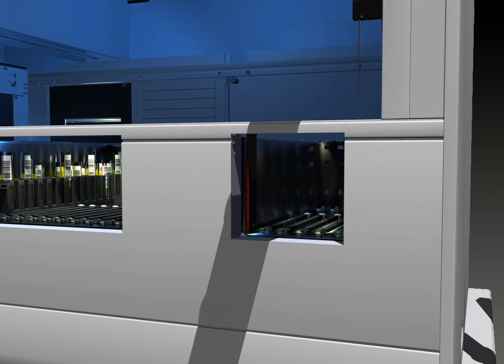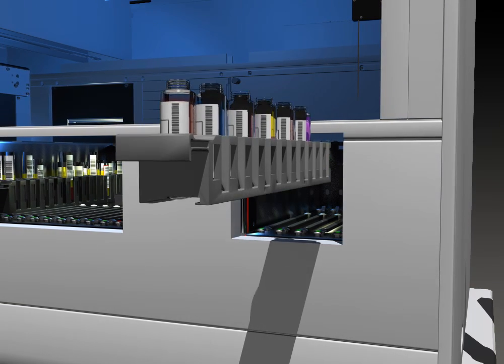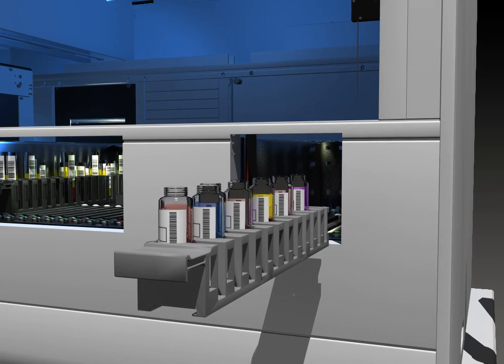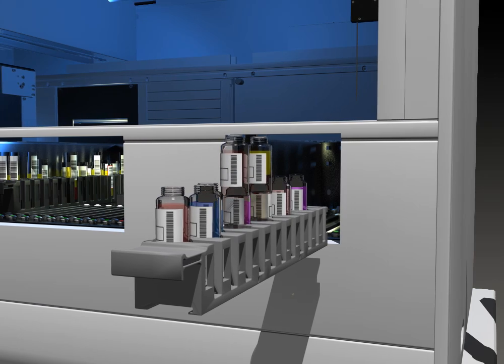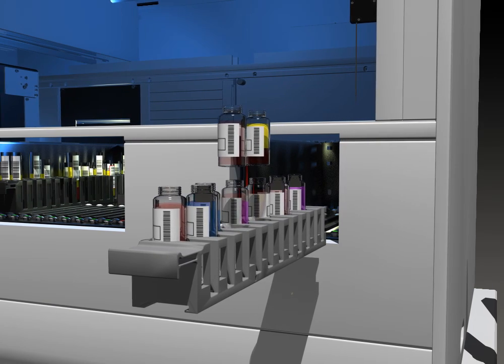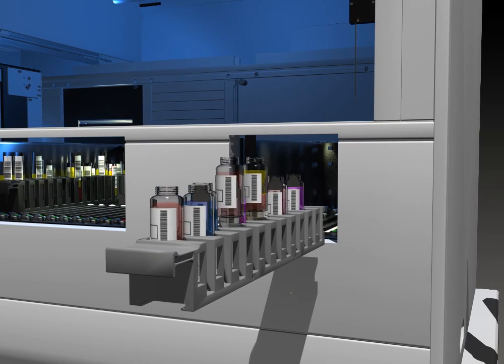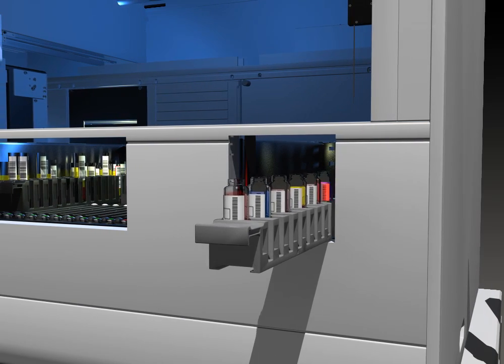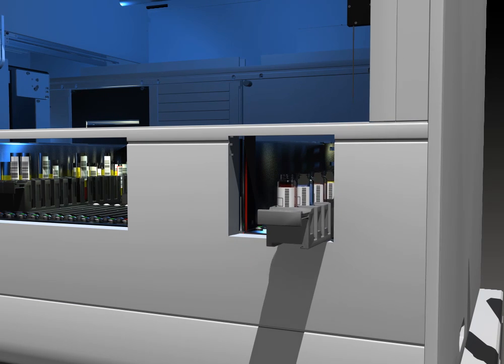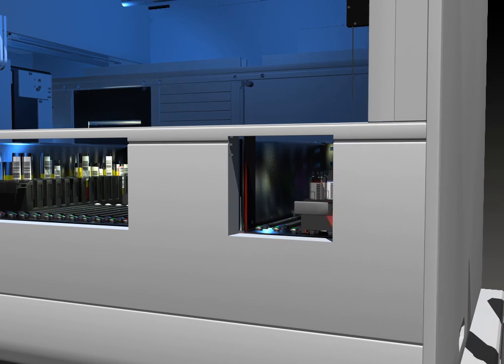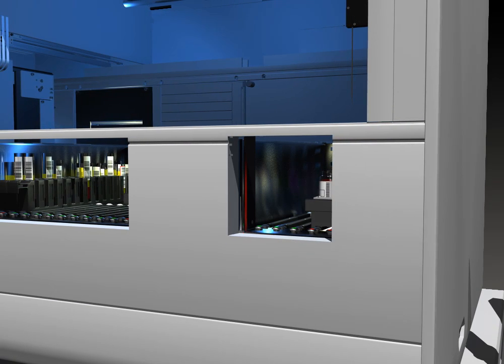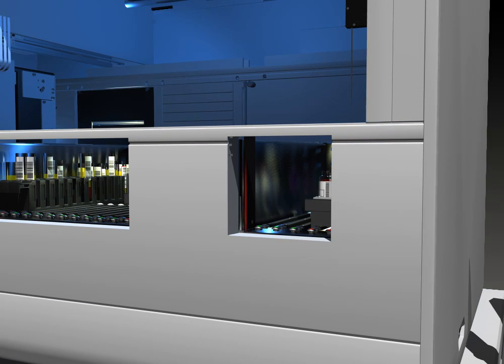By using linear racks, the operator has continuous access to loading and unloading samples. The linear rack contains positional barcodes, which the NEO reads in tandem with the sample and reagent barcodes.